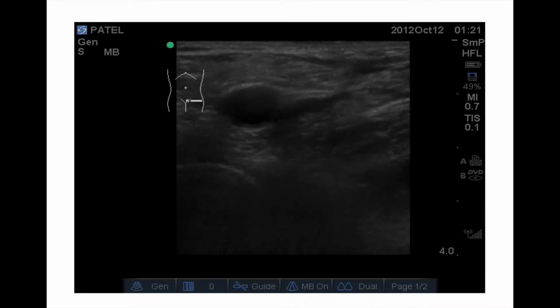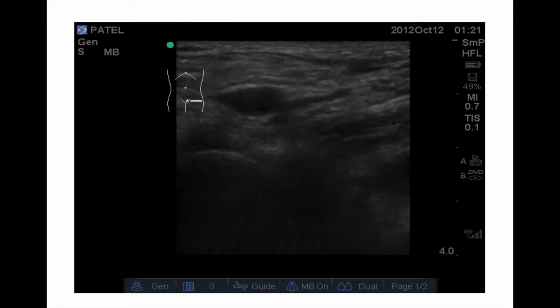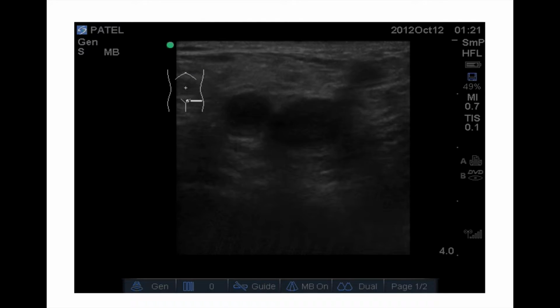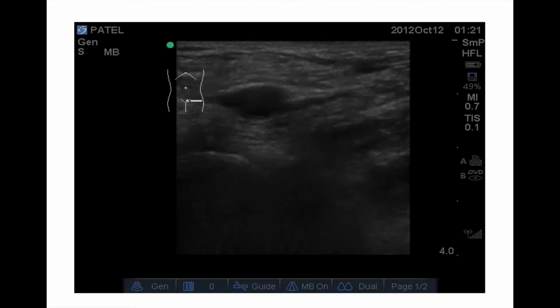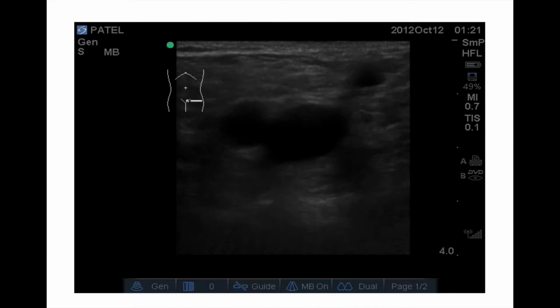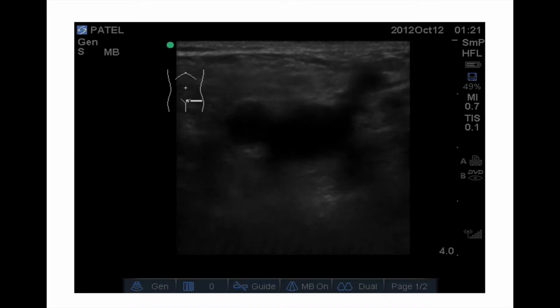Here's a clip of us doing that. So here you see the artery on the left and the greater saphenous vein takeoff on the right. You can see it's totally collapsing. I do make a little bit more quick movements rather than what I just showed you with the previous slide, but you can make a little bit slower movements, it's okay.